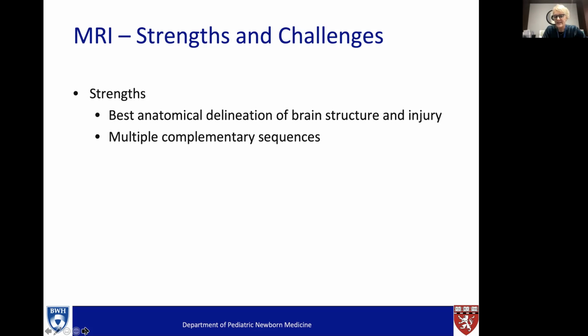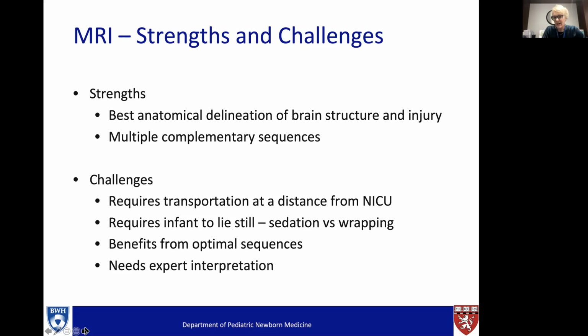The strengths are that it is the best anatomical delineation of brain structure and injury that exists, and that there are multiple different complementary sequences, as they are called, that provide insight into either structure or into potential stress or injury in the brain. But there are challenges.